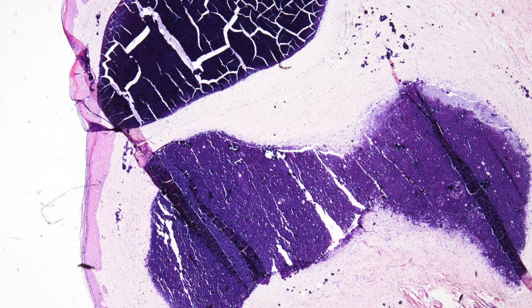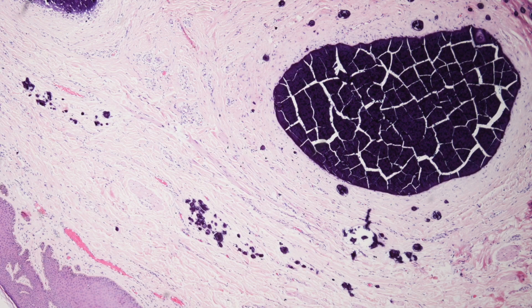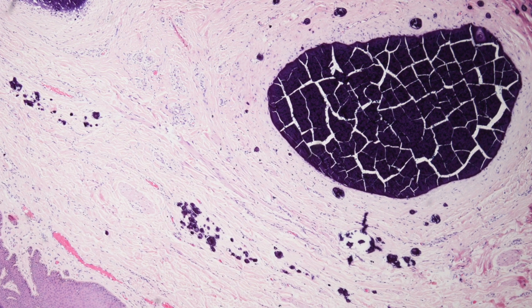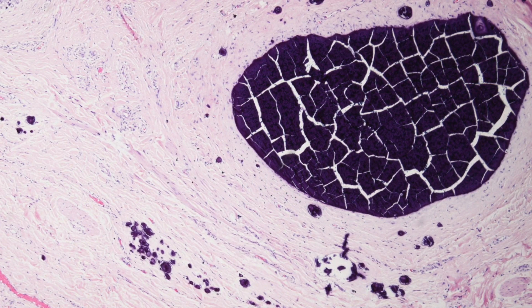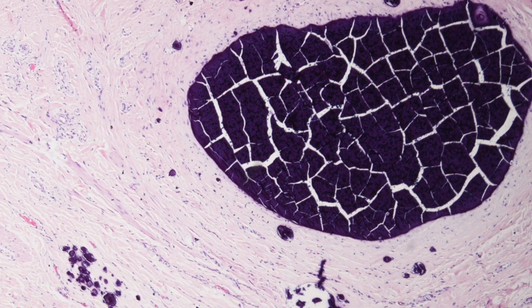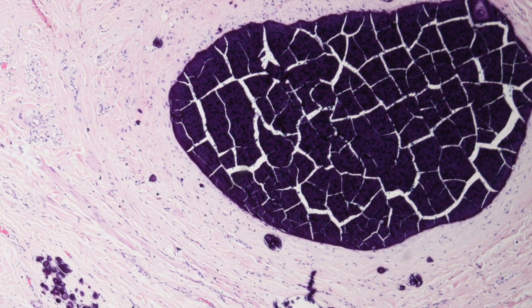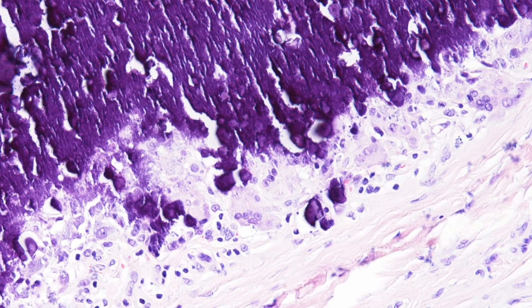The seventh case was a scrotal cyst from a 22-year-old man. This is idiopathic scrotal calcinosis. You see deep purple calcified nodules in the dermis, usually surrounded by a granulomatous inflammatory response. Scrotal calcinosis is the sort of condition where you don't really need a microscope to make the diagnosis, because you can see the purple masses on the glass slide before you slip it under the microscope. The low power shows a well-circumscribed deep purple mass, and at the periphery there is a granulomatous inflammatory response with some multinucleate giant cells.